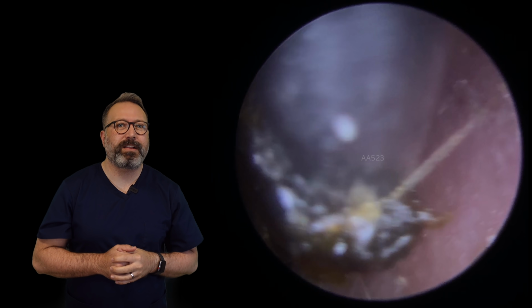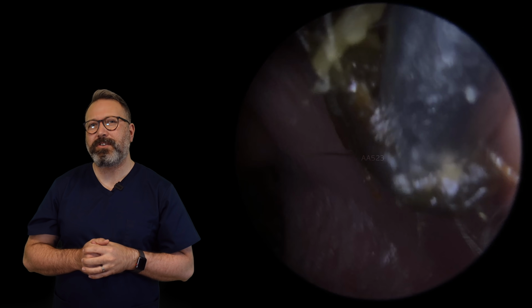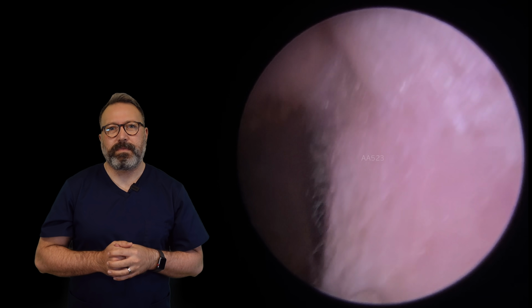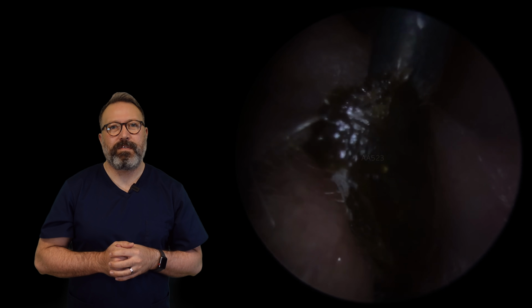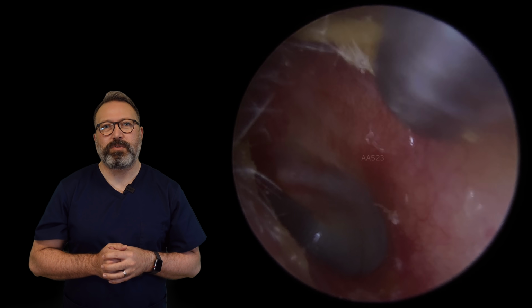Look at that coming down the canal. Luckily, the whole thing moved. There's a bit of a tail attached to that, I think. I think we might have just left a little bit just at the entrance to the canal. Yeah, there it is. So, oops, missed it. Let's go back in and grab it again. There we go, out that comes. Perfect. Really kind of smooth side. You can see it's been attached to that canal wall. Eardrum looking much, much better.